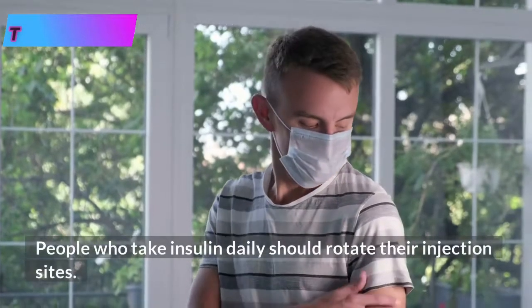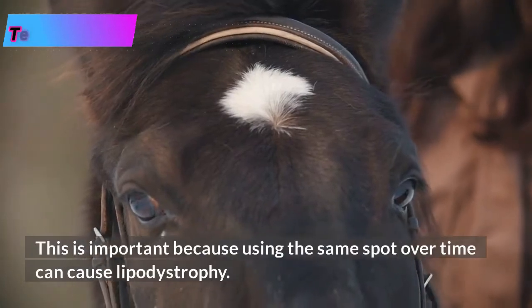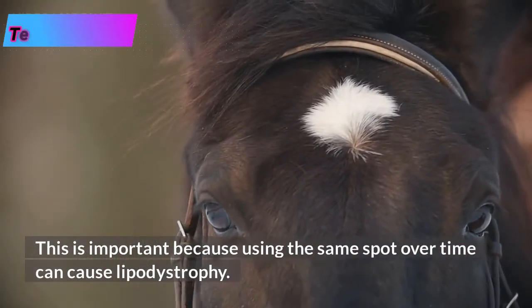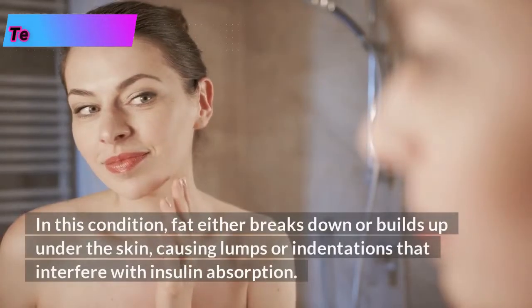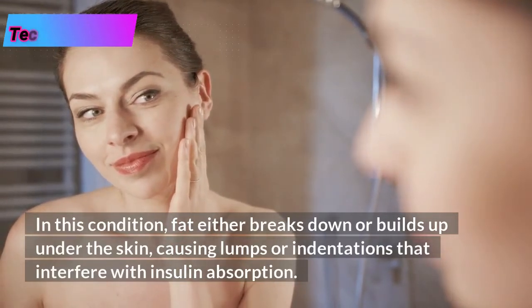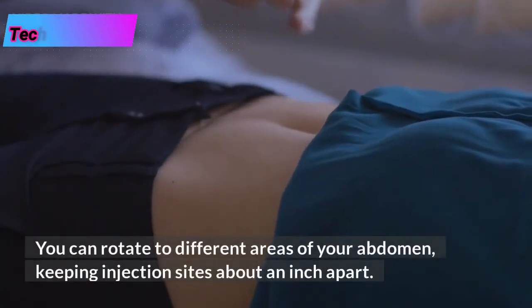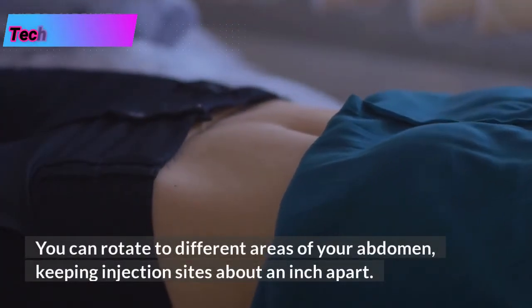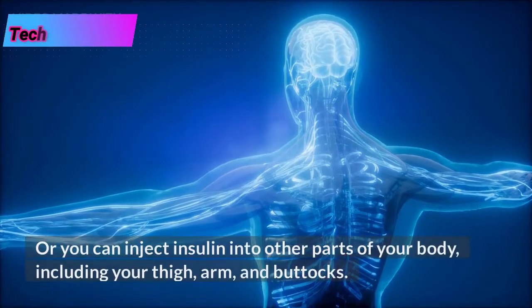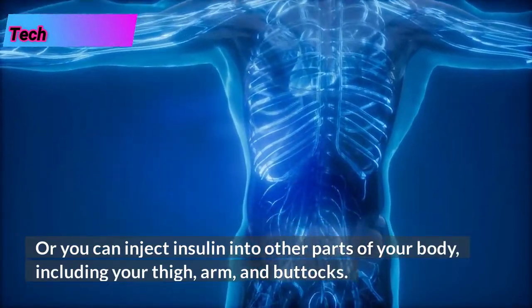People who take insulin daily should rotate their injection sites. This is important because using the same spot over time can cause lipodystrophy. In this condition, fat either breaks down or builds up under the skin, causing lumps or indentations that interfere with insulin absorption. You can rotate to different areas of your abdomen, keeping injection sites about an inch apart. Or you can inject insulin into other parts of your body, including your thigh, arm, and buttocks.